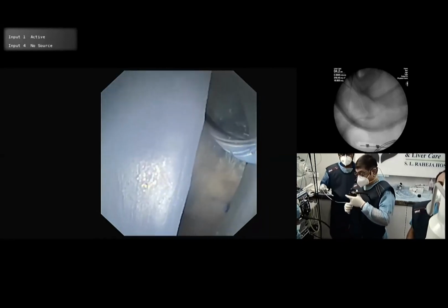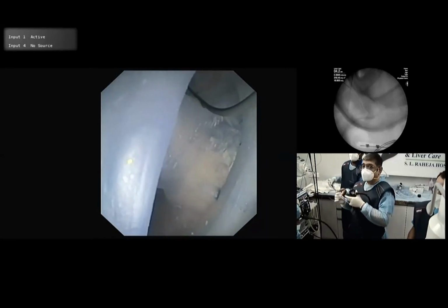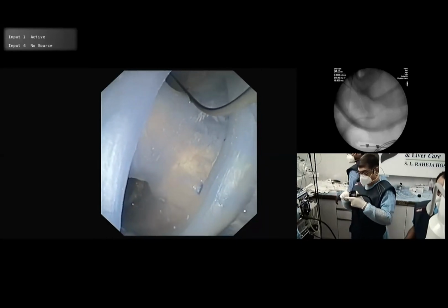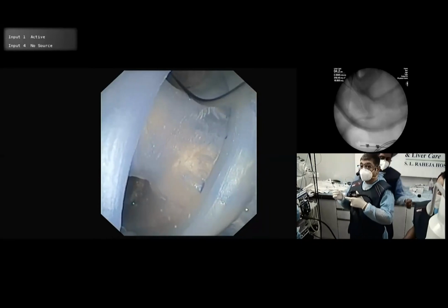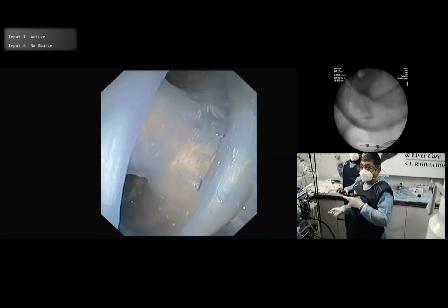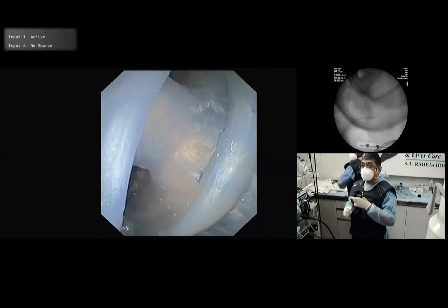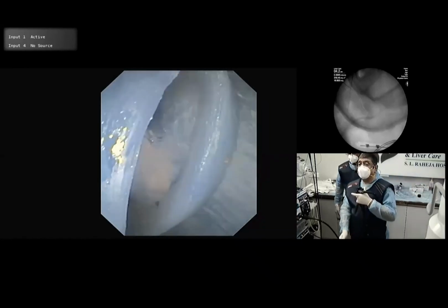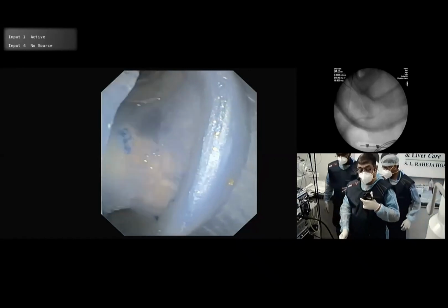Now I will, in 5 minutes, quickly show you the other areas. I will not do any other procedure. So this model, we plan to use it, make it better for more complex procedures and use it for ERCP training also in the future.